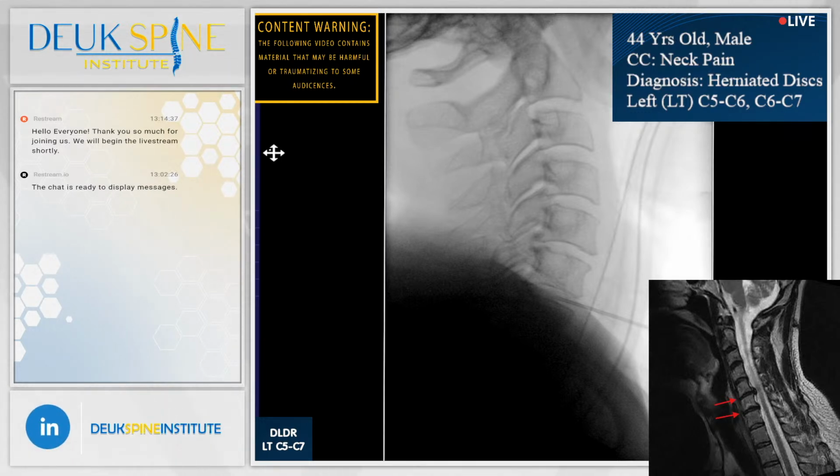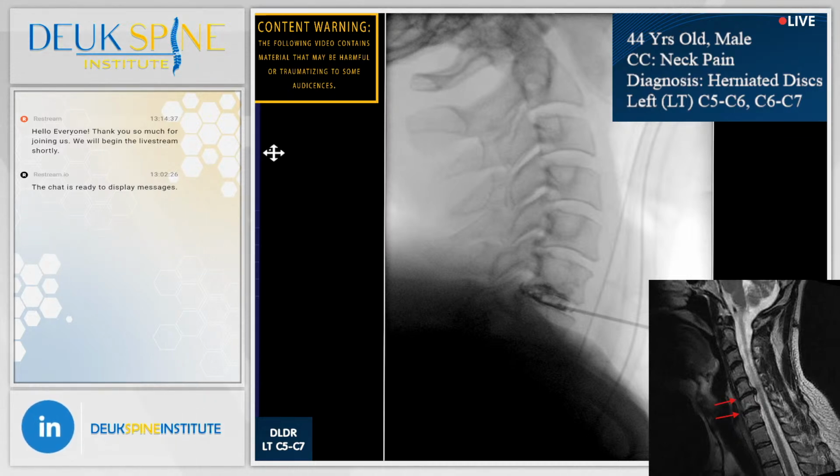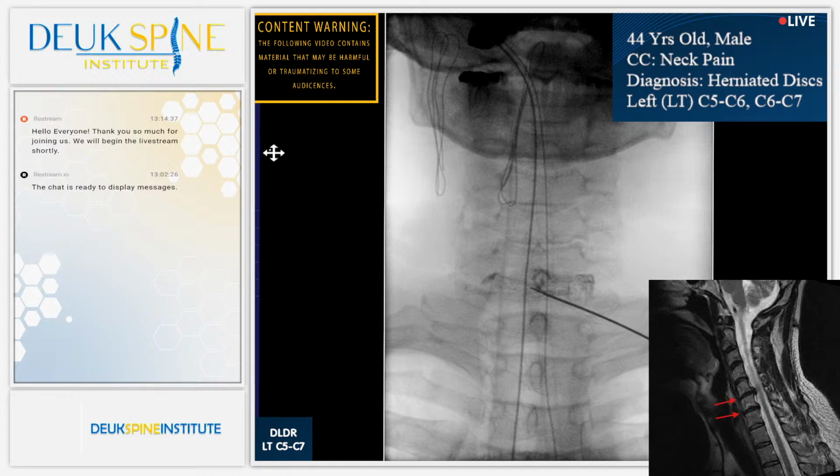And shot. All right, we're going to see the tear. There it is. Look at the size of that tear. It's massive. That's all the black dye leaking out the back of the disc. It should be staying in the middle. Perfect. Give me an AP view. We're going to get another view from the front, and it'll show the dye leaking out the sides. There it is. Look at that. Show the dye right there, Jordan.